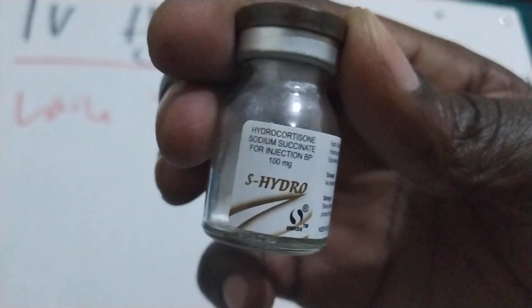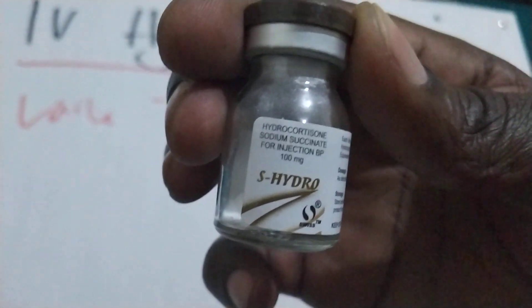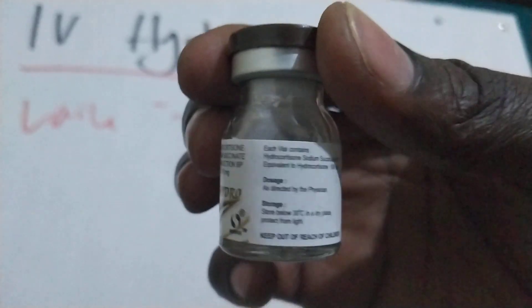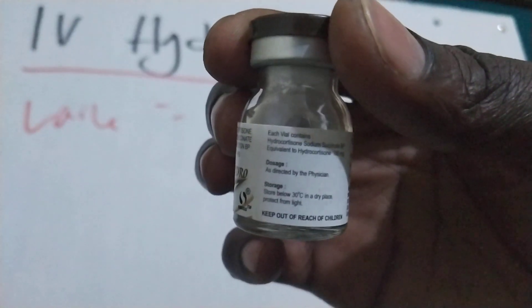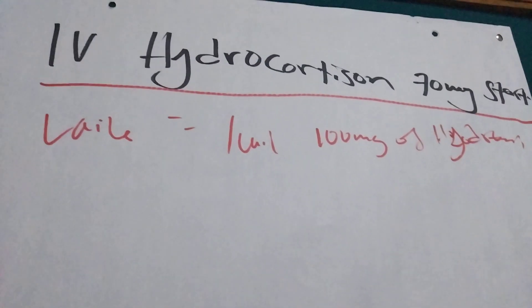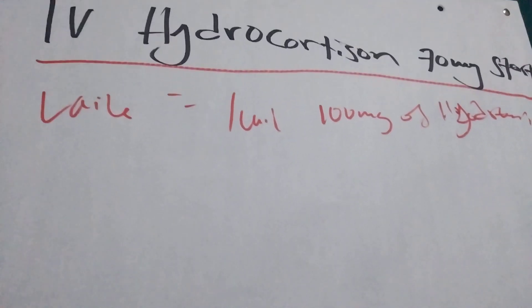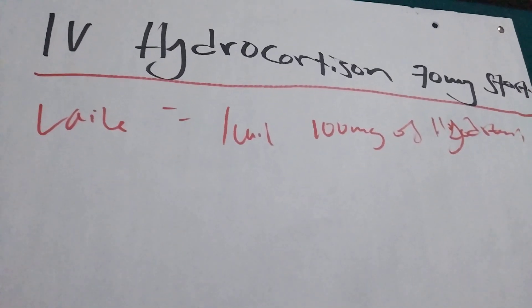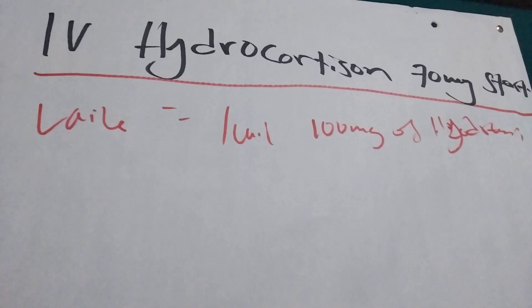So this is hydrocortisone 100mg in one vial as you can see. I am going to show you how we can dilute it for children and for adults also. So let's start.